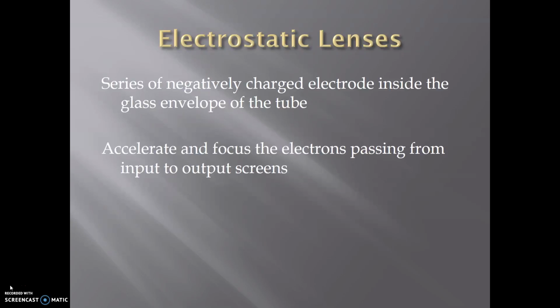Electrostatic lenses are a series of negatively charged electrodes inside the glass envelope of the tube. The purpose is to accelerate and focus the electrons passing from the input screen to the output screen.